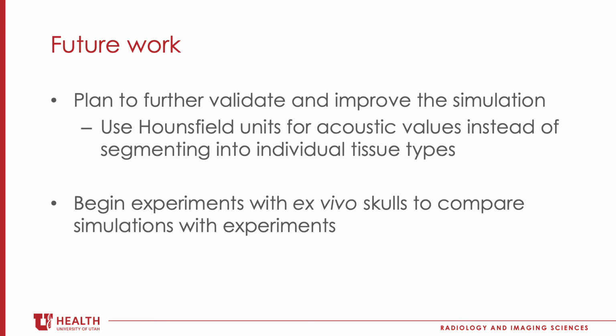We plan to further validate and improve the simulation by using Hounsfield units for attenuation values instead of segmenting into the 7 individual tissue types. In addition, we will also begin performing experiments with ex vivo skulls to compare simulations to experiments.